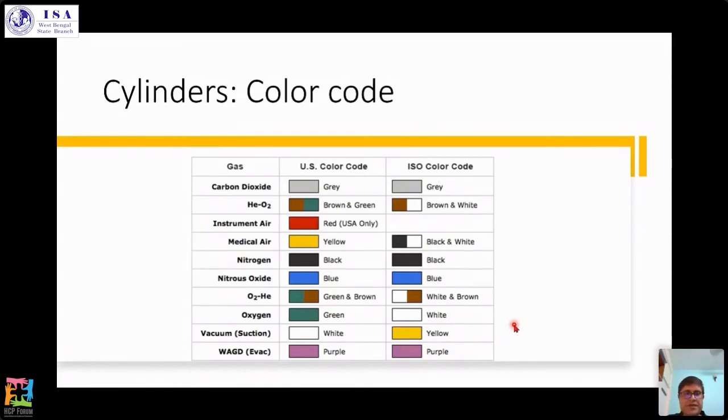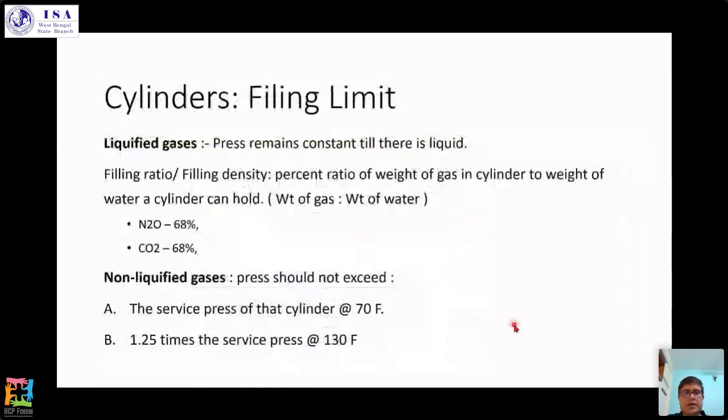Now sometimes these are also used on the pipeline system as well. Filling limit: how far you can push a cylinder, how much gas you can put in it. We'd like to put in as much as possible. If we're talking about a liquefied gas, the pressure will remain constant as long as there is liquid. So that means we'll use most of the gas present in the cylinder, but when the liquid is gone and the pressure starts to fall, it will fall really fast.